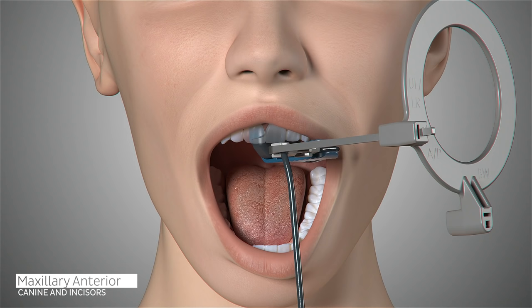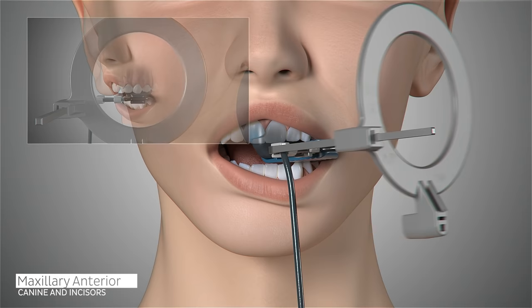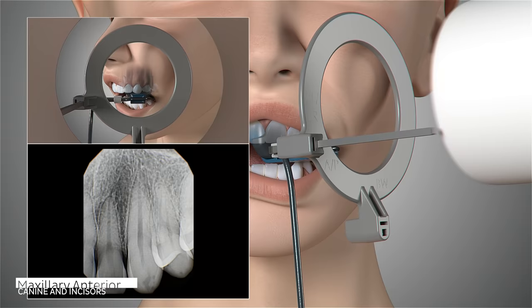Ask the patient to open slightly and reposition the sensor to the left canine. Position the sensor so that the canine is centered on the sensor, well into the palate and parallel to the long axis of the tooth. Ask the patient to close and slide the aiming ring as close to the patient's face as possible. The cone of the x-ray emitter must be placed flush with the aiming ring and then trigger your exposure.